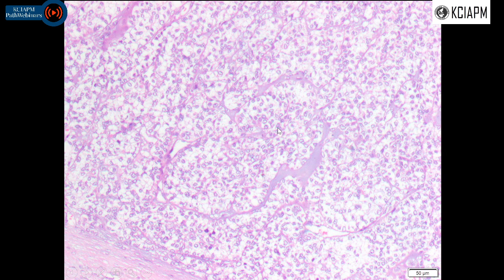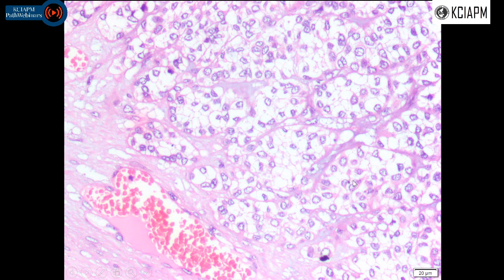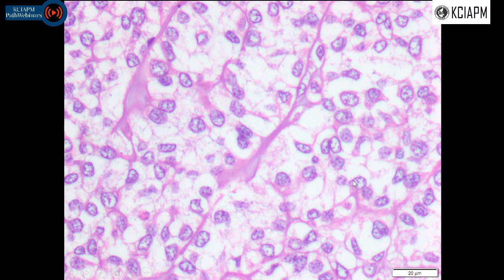they're very cellular. I mean, the neoplasm is very cellular, but they have very distinct clear cytoplasm. The nuclei are vesicular, they are small in comparison to the amount of cytoplasm, which is so empty looking. So exactly clear cell, and these are the thin septae which seem to be hyalinized. They are highly vascular. You see the thin sinusoids intercepting between them. So going higher, yes, they look very monotonous. The nucleoli are not seen.